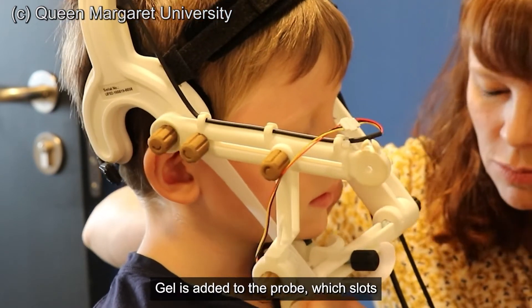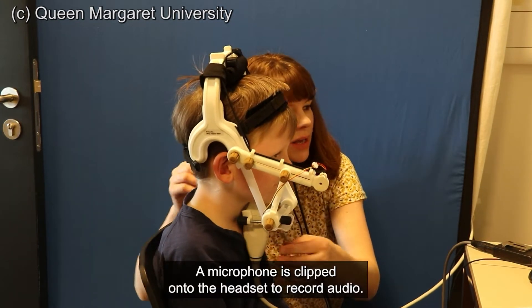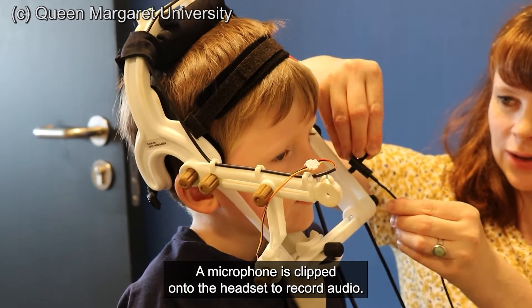Gel is added to the probe, which slots into a holder underneath the chin. A microphone is clipped onto the headset to record audio.